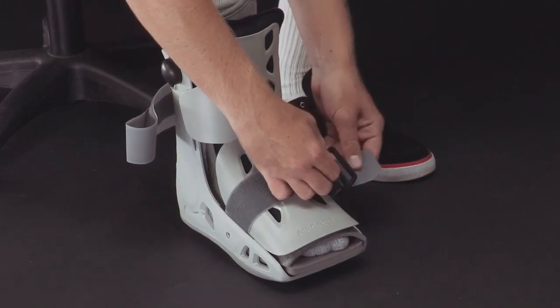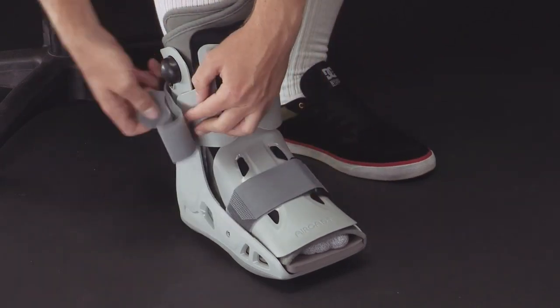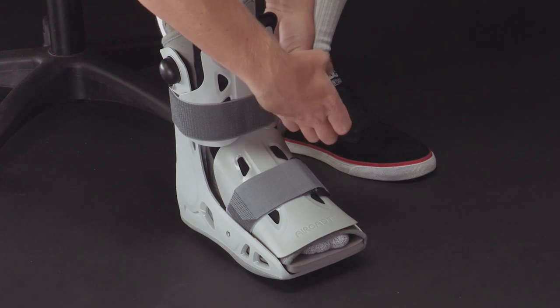To complete the application, secure the straps from the bottom of the boot to the top. Tighten the straps until the boot is snug yet comfortable.